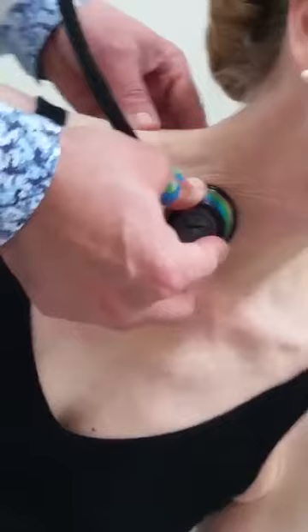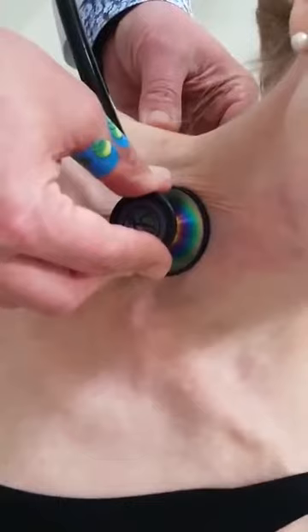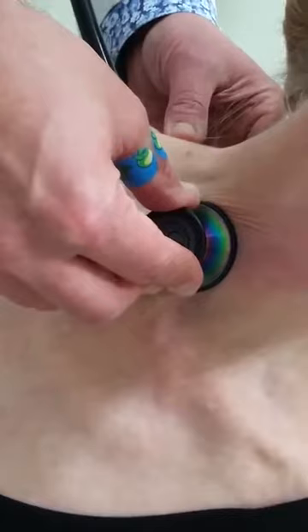Tell the person to take a breath and hold their breath while you listen. The reason we do this is because very often a soft bruit, which is created by narrowing or stenosis in the carotid artery, can be obliterated by a person's respiratory effort.